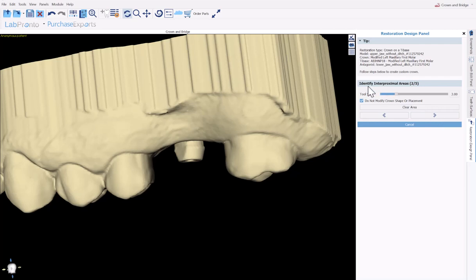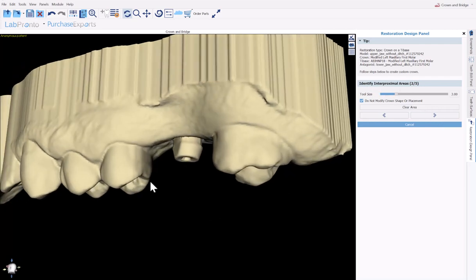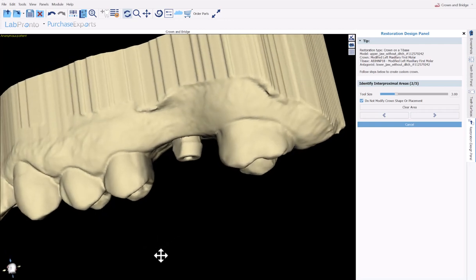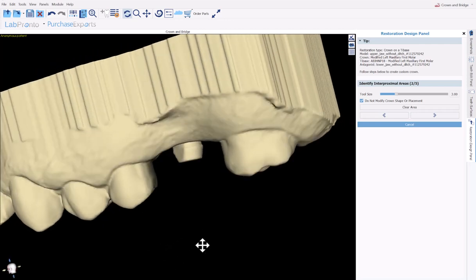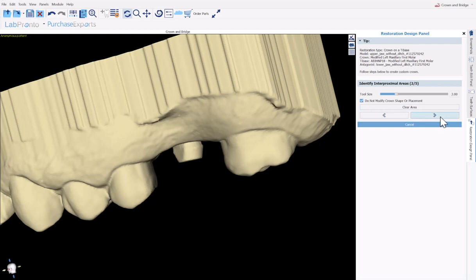We could identify the proximal areas by holding down the shift key and the left mouse button. But this is only if we want to modify the shape of the crown. Since we have done that already, and there's no need, simply confirm do not modify crown shape or placement is checked, and then just click next.